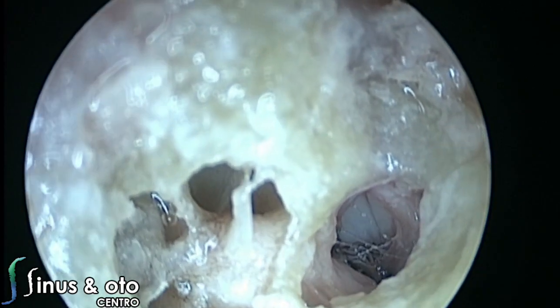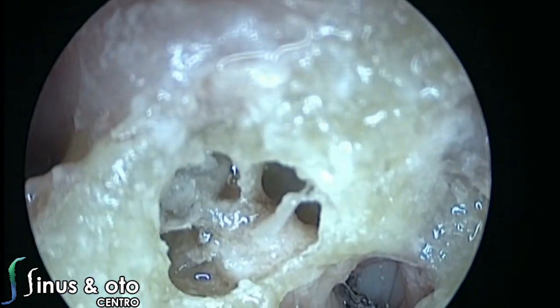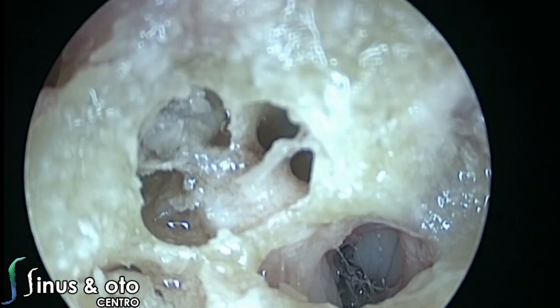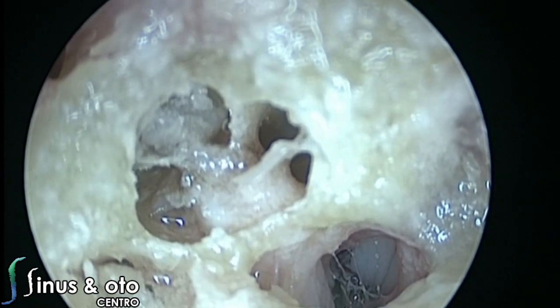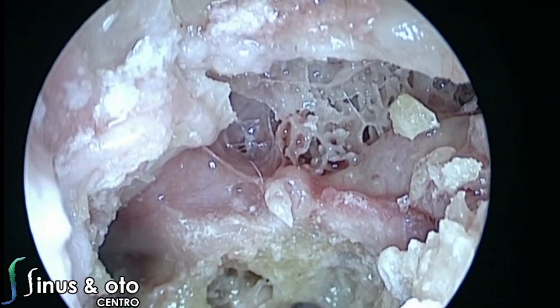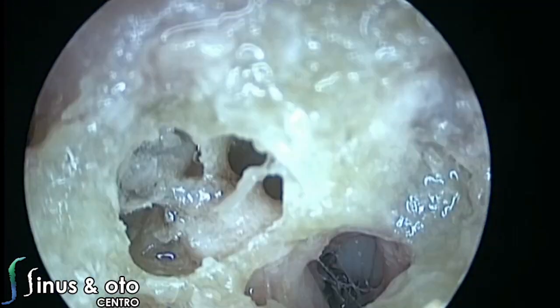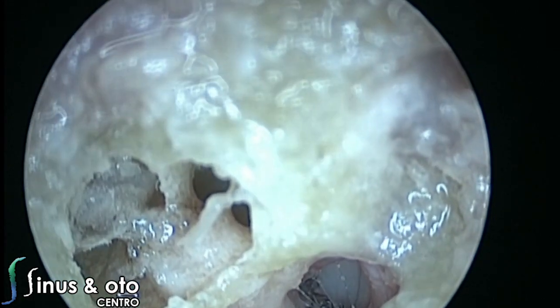The same structures, the same name, the same anatomical things can have different views or different configurations when you see through a microscope, through an endoscope, or with your bare eyes, but also according to the approach that you perform. So when you do a retrosigmoid approach, the anatomical structures, although the same, are in a different configuration, a different position.